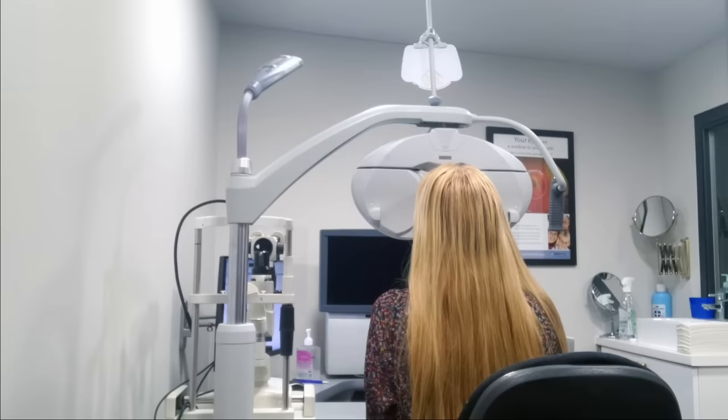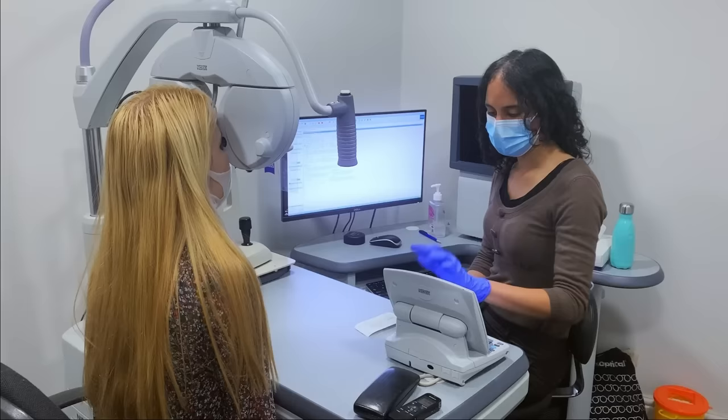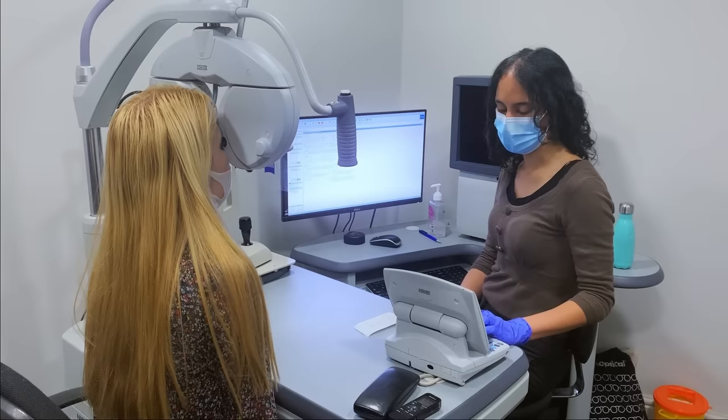Okay, good. And then between number three now and number four? Number three. Okay, good. So again, if you look at the numbers on the red and the green, do either stand out more now? Yeah, the red does. Okay, great. And how about now? Now the green does. Okay, good.